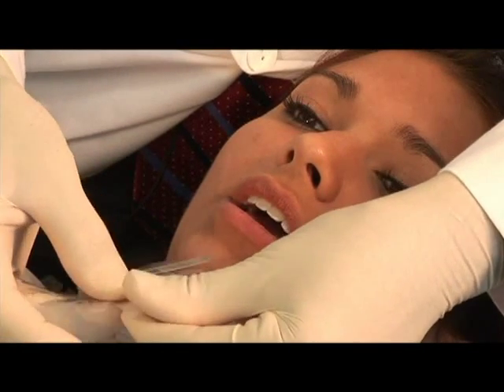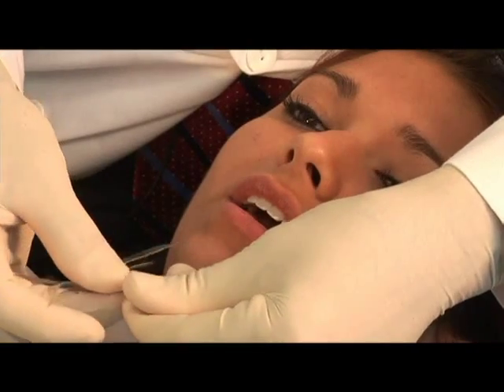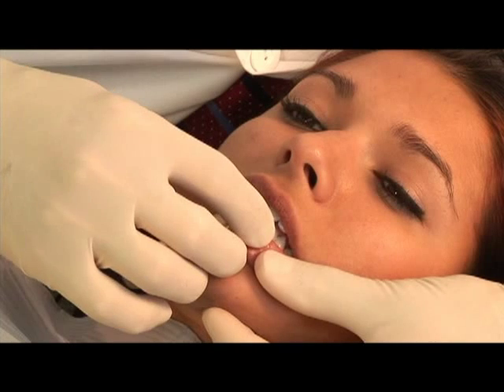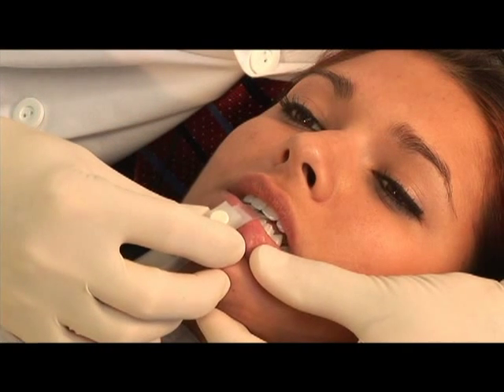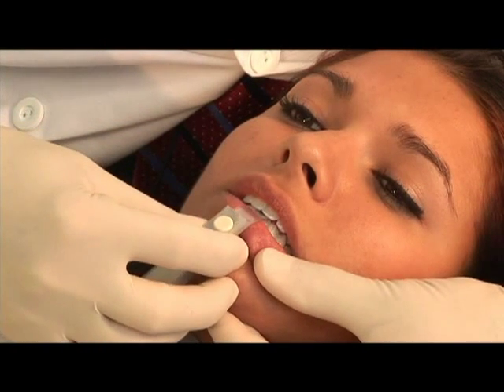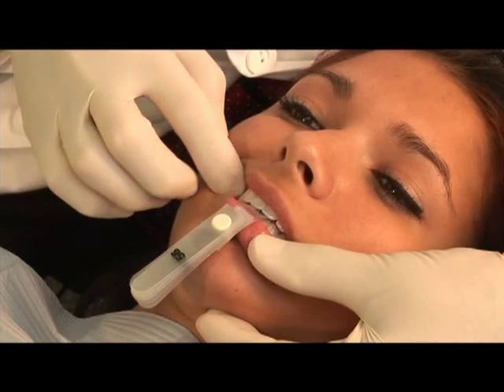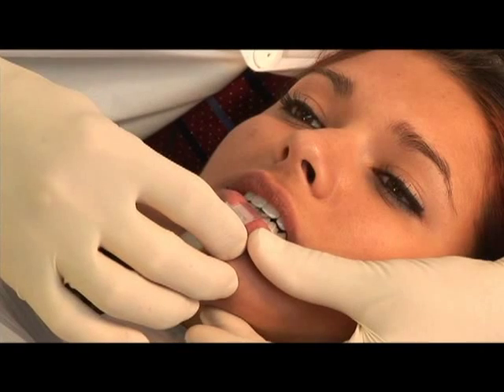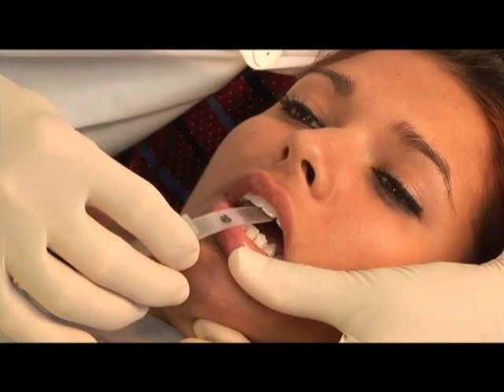Let's decrease it down to about 10 leaves here. Okay, now close for me again. Slide forward and back. Feel any teeth contacting there at all? No. Okay, open here for me. Stay open just like that.